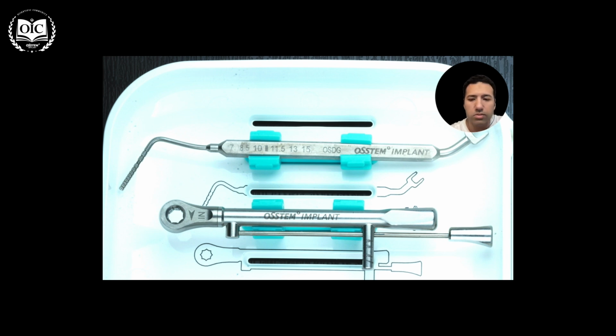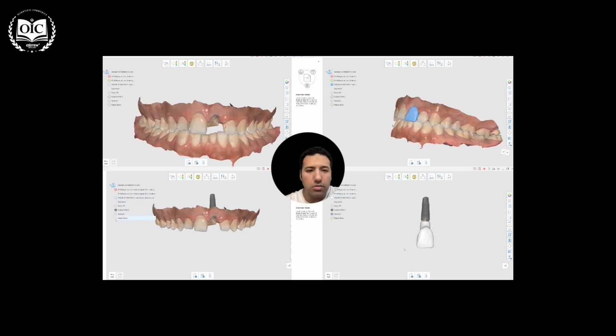Also the torque wrench, one of the best latch mechanisms on the hand torque wrenches that never misses, and with very minimal problems over a very long time. I've been using mine for 4 years so far, and it's as good as new. Let's start with our cases.